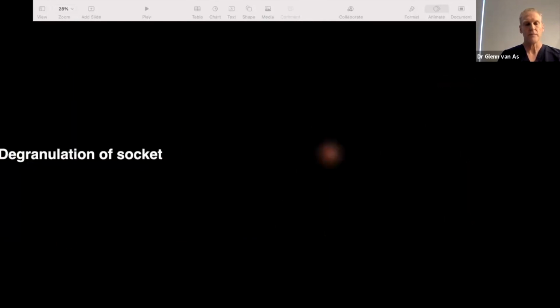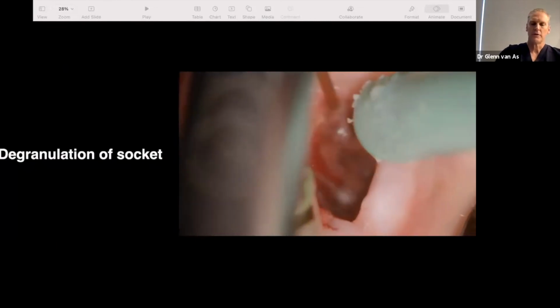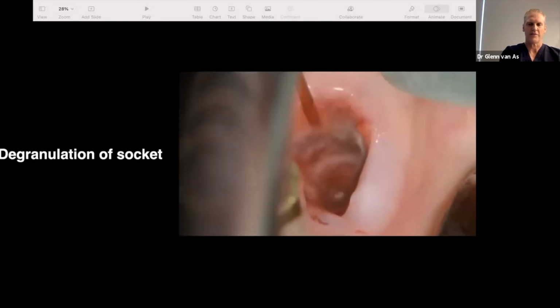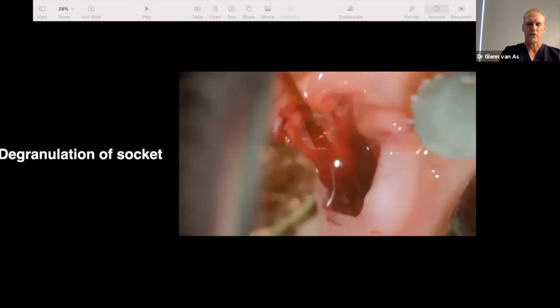So the laser is really cool because you can peel the soft tissue off the bone. So that's what I'm doing here. I'm actually peeling the soft tissue. I don't know how many of you like threading these, but it's not easy. You can take a burr in there, a football-shaped burr, but you can see how quickly I was able to get that soft tissue to peel off there. And it's amazing how you can clean out the socket and remove the granulation tissue, and how much granulation tissue is existing in some of these cases.